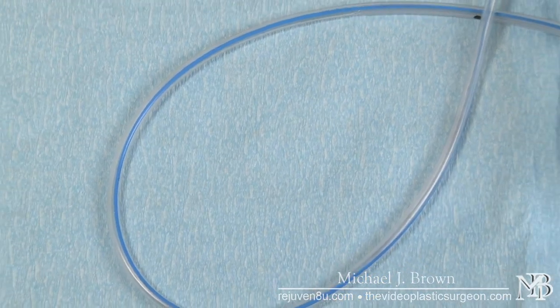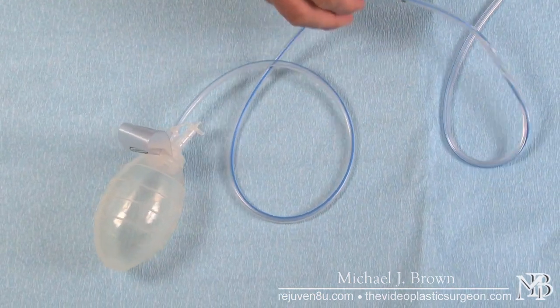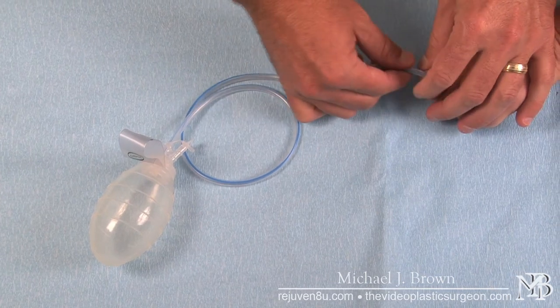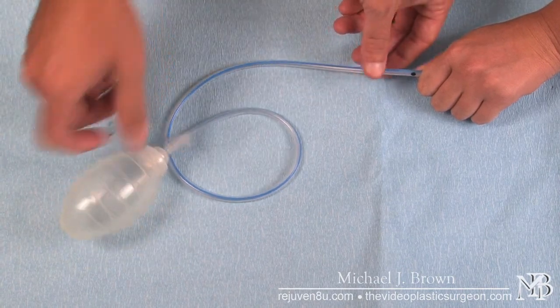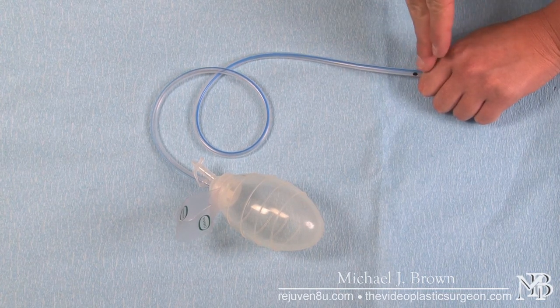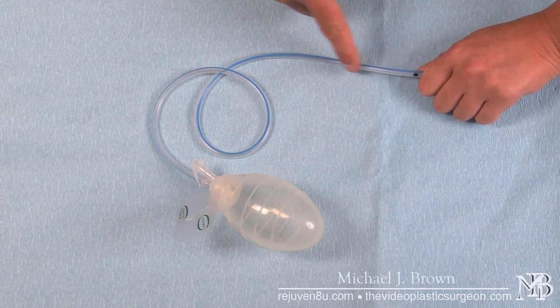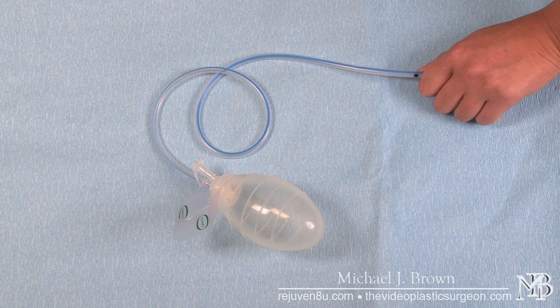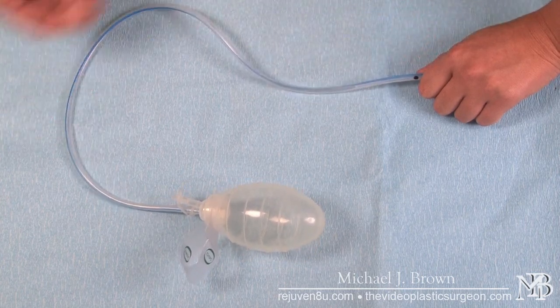As far as drain maintenance other than recording outputs, I want to demonstrate what it looks like when a drain is in a patient. For demonstration purposes, we're going to pretend this hand is the patient — inside the skin, abdomen, breast, or wherever the drain is needed. The drain is sewn into the skin and secured tightly so it cannot come out. This length of tube will vary depending on the area where the drain is placed, and a short drain is only about 24 inches or so.